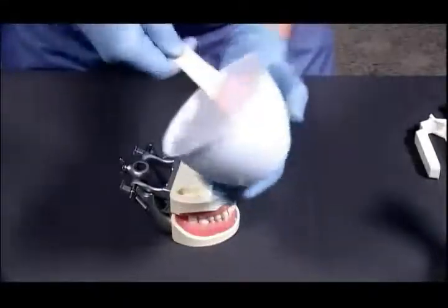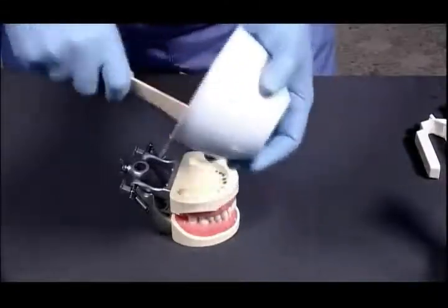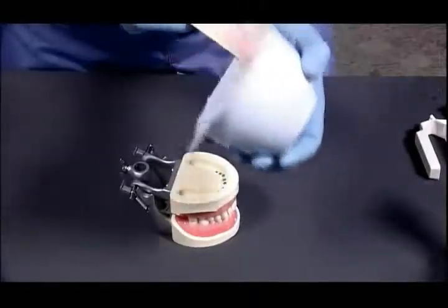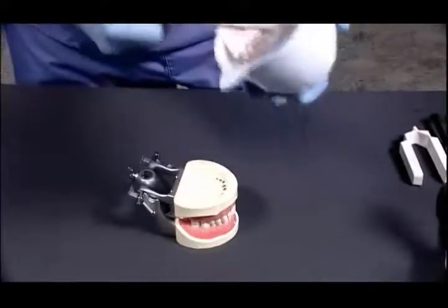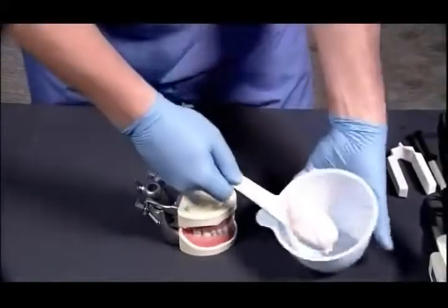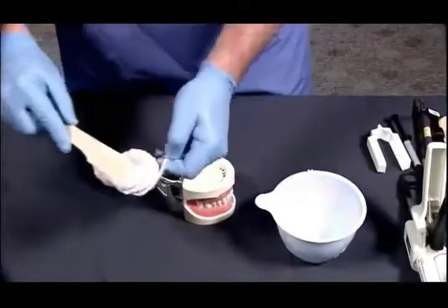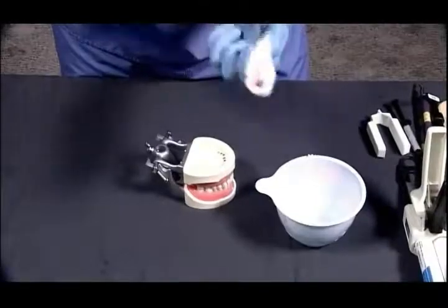And then once the alginate is mixed, I'm going to be switching to put the hydrocolloid into the impression tray. We're going to be utilizing a dual arch impression tray. In this particular situation, we're using an impression tray from Clinician's Choice, and I'm loading that impression tray at this point with the alginate.